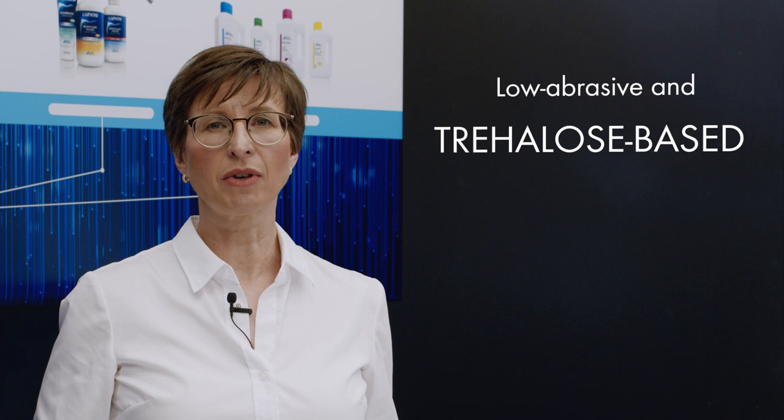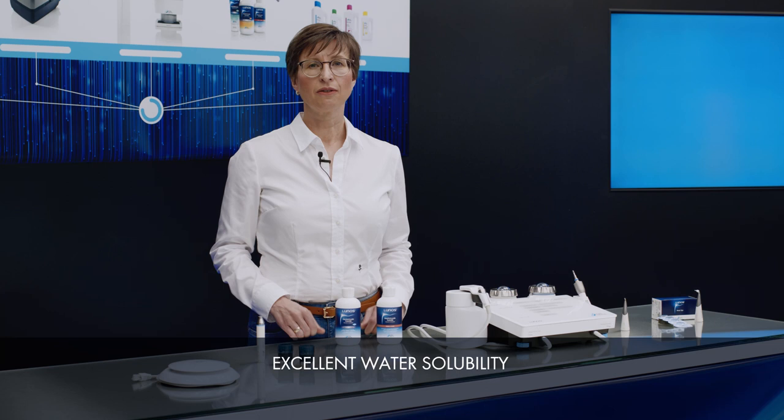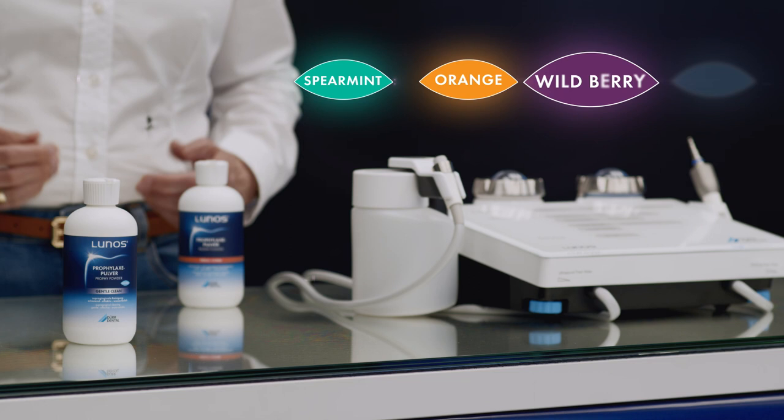Our low-abrasive, trehalose-based LUNOS prophy powders are available for the powder jet application. Trehalose is non-cariogenic and demonstrates excellent water solubility, protecting both the suction unit and amalgam separator. LUNOS prophy powder gentle clean, which has an average grain size of approximately 65 micrometers, is suitable for supragingival cleaning and is available in several flavours.